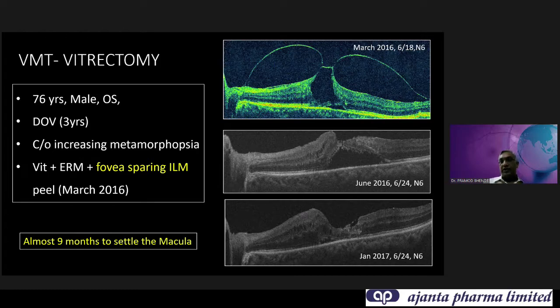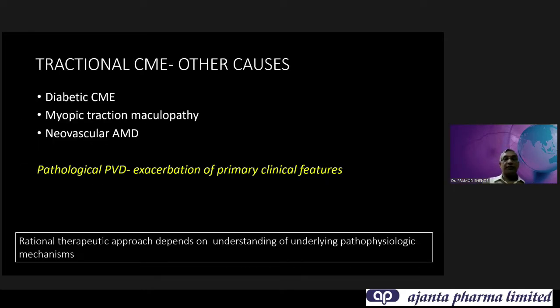But the patient does have some defect, you see the RPE is practically not there, the ISOS junction is gone. So in fact, pre-surgery vision, which was 6/18, is now maintaining 6/24 and N6. But sometimes that's what we have to accept in a situation.